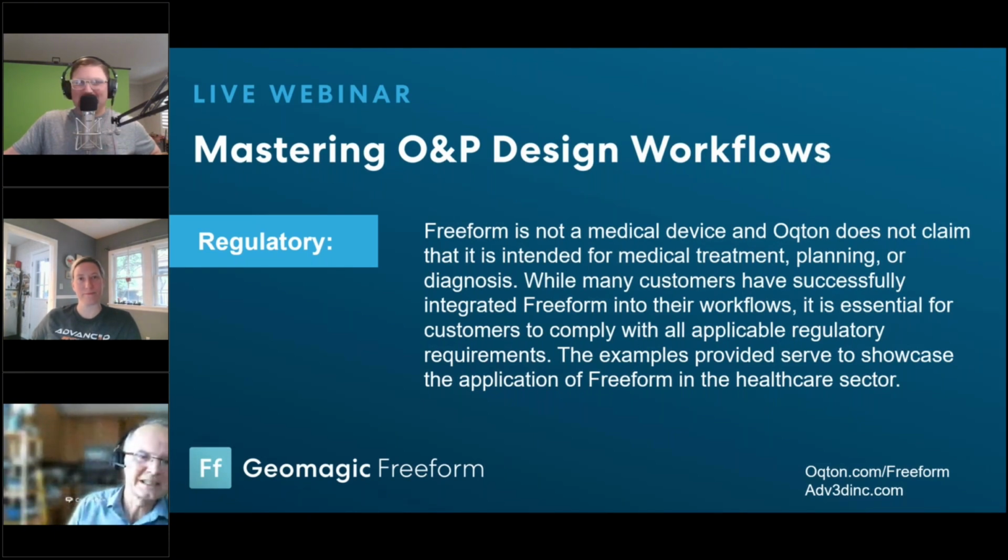And if you have any questions about, okay, well, you're saying Freeform's not a medical device, so how do I get it working within my framework? Then please feel free to reach out. We can certainly discuss those and answer those questions.